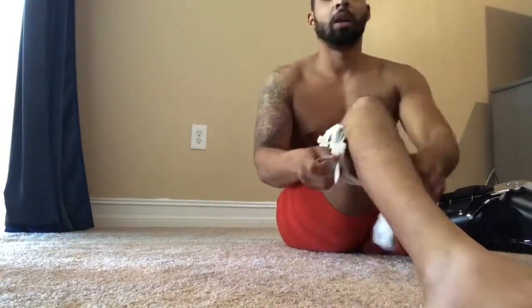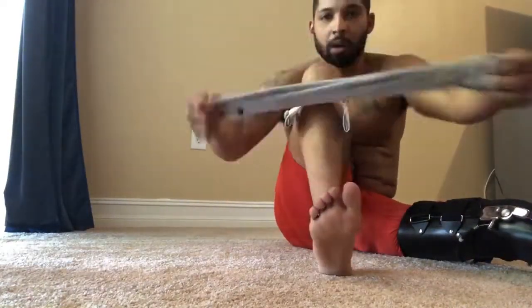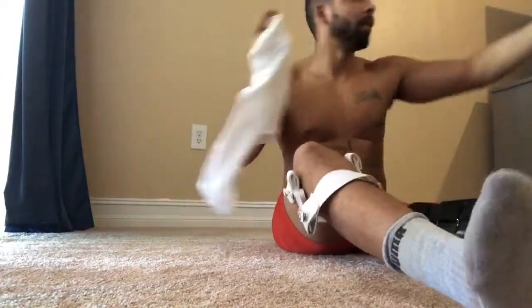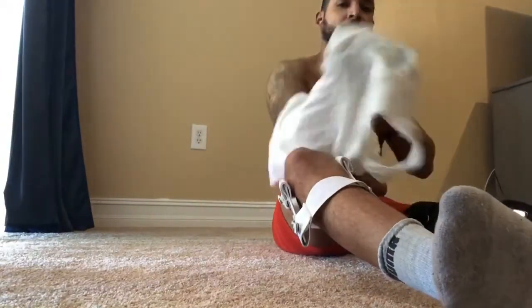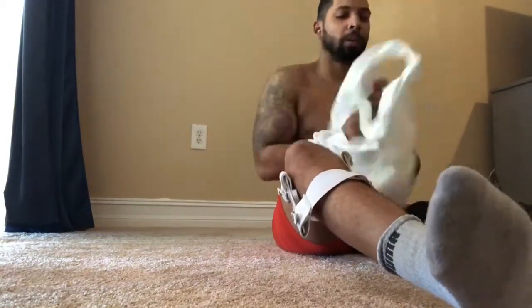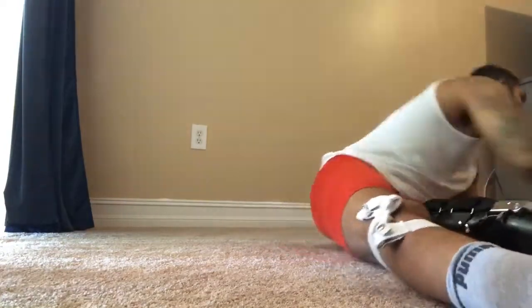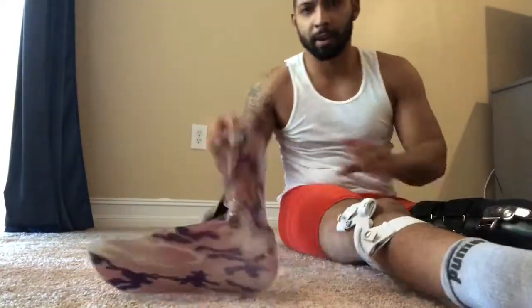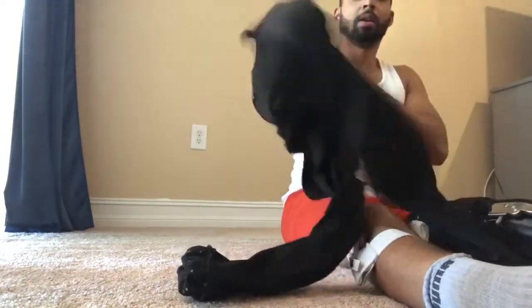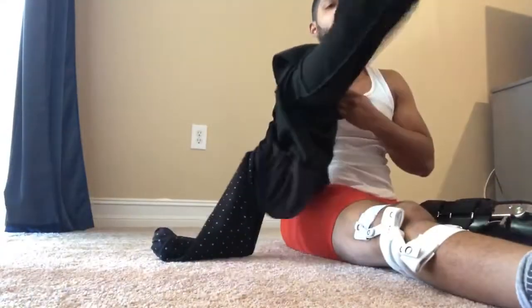Swedish knee cage on the right leg for extra support while I'm working out. There's my other sock. There we go. First I got to put my pants on, then we'll put the AFO on. I'll show you how to put the AFO on.